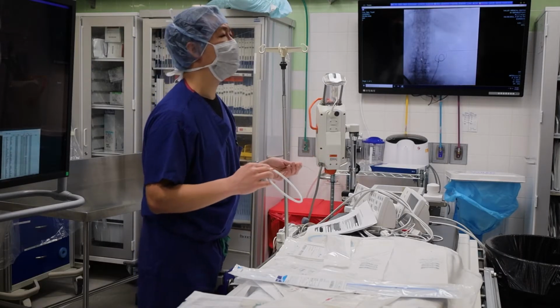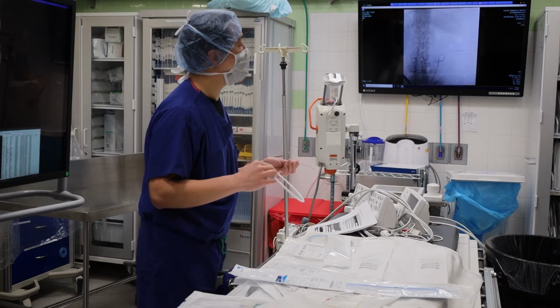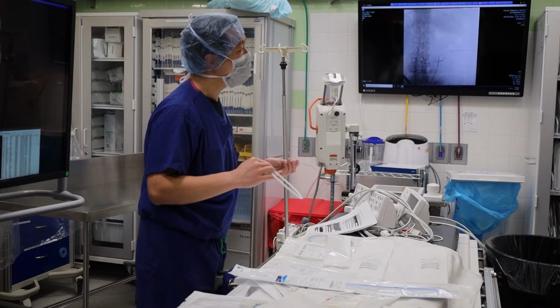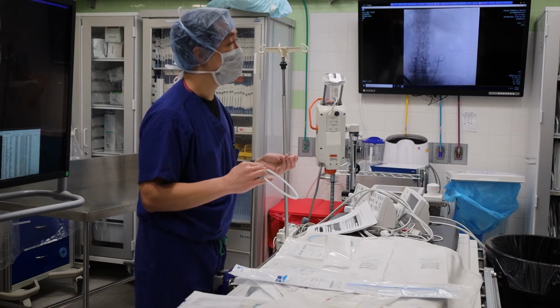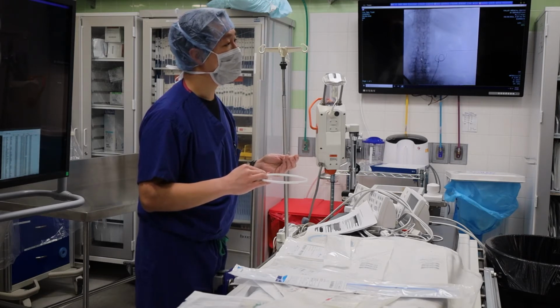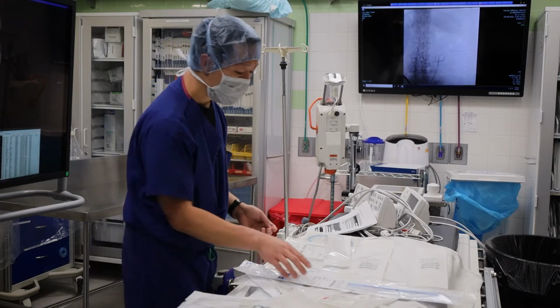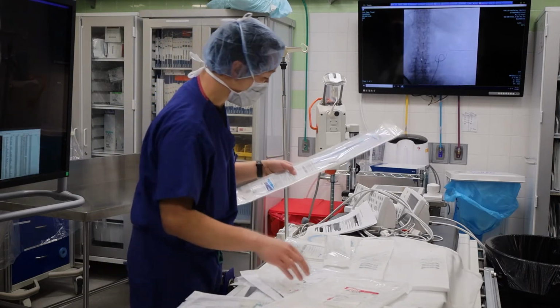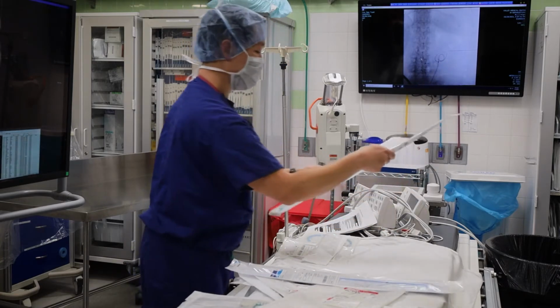What lengths do I need? Do I need a really long wire or do I need a short wire? Why do I need a short wire? Why do you need a short wire? Yeah. Because you're only going to the kidney. And you don't want to have the possibility of it pulling out. Maybe. It's all driven by, more support.